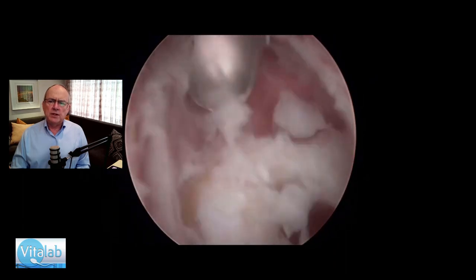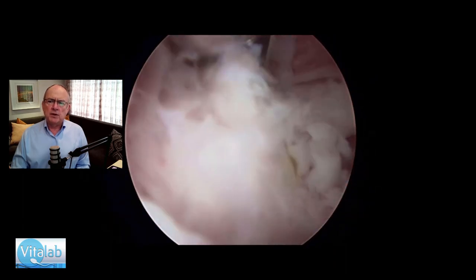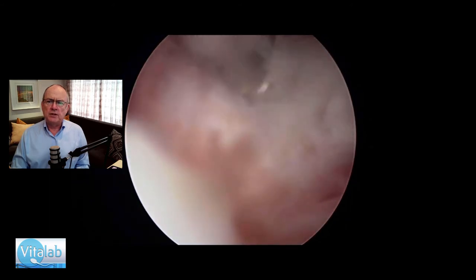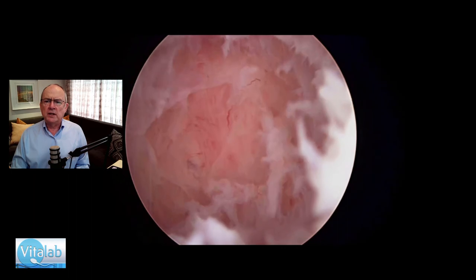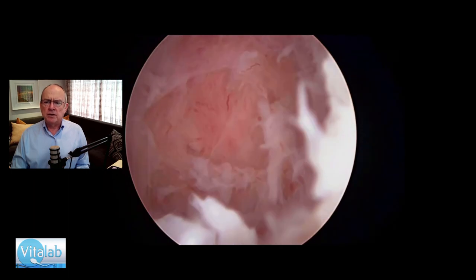As you can see, there are no bubbles, there are no bits and pieces that we have to remove with a separate instrument. Take your scope out and there we are with the finished product — an amazing result.